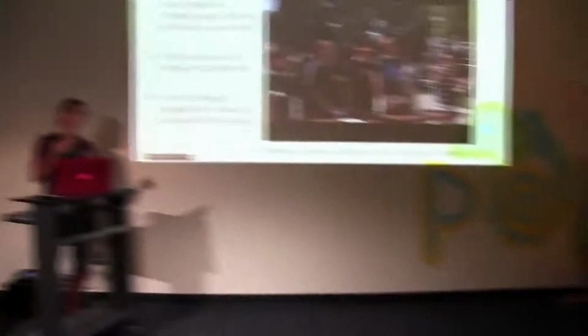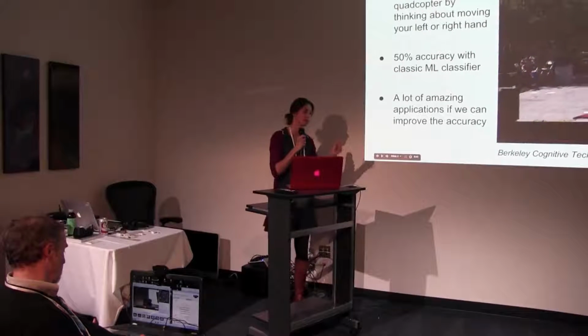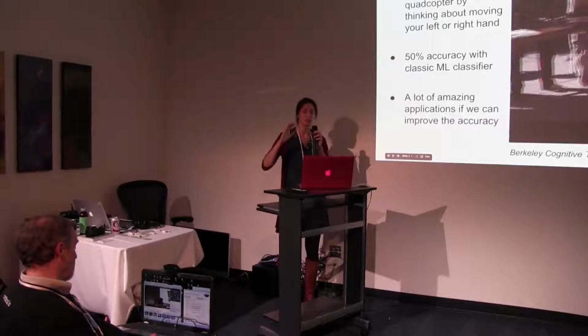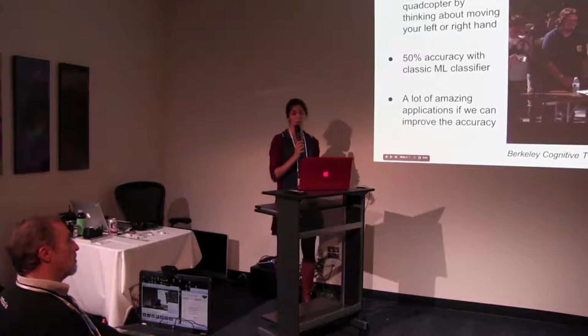You could calibrate, put the EEG on, calibrate. Exactly. So this is why there are 2 phases. One, training, exactly like what you did, right? I train it on a data set, that is the training phase, where we tell the guy, okay, move your left hand, move your right hand. We feed it to NuPIC, we freeze the model, so that's the training part. And then after that, you're just streaming in new data.